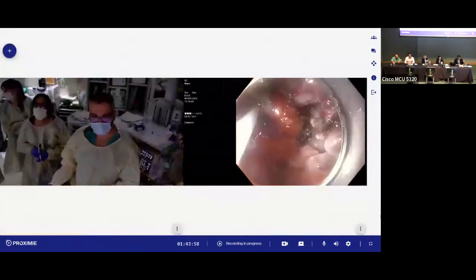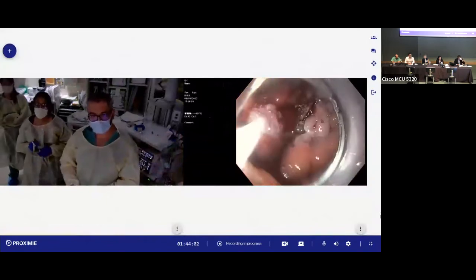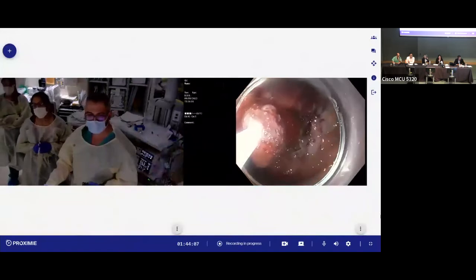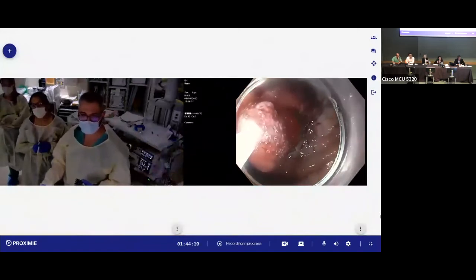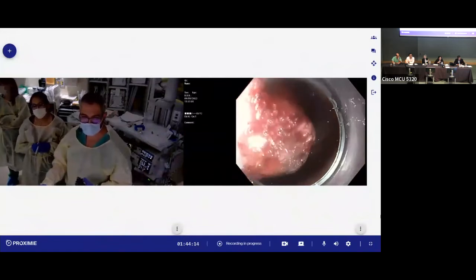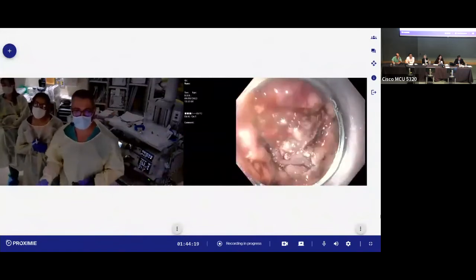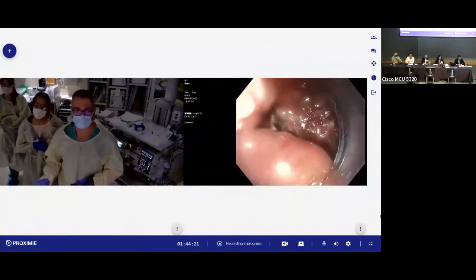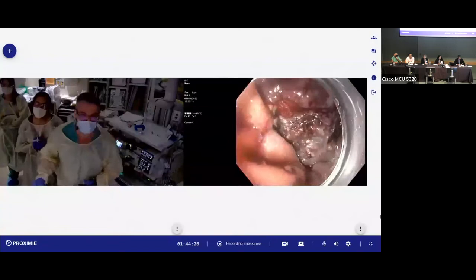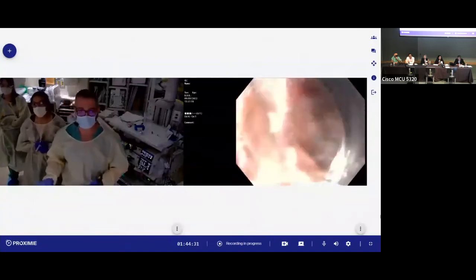Hello, we're back. Hello. We're almost finishing here. We're just in the last piece of the lesion. Tell us what you've been doing. You've been debulking from the endoscopic view. Have you had a direction that you've been working with, or just going with whatever comes? Basically we removed all the large parts, we can show it to you, and now we're getting all the way down. You can see here it's not pretty work because we have a lot of blood, but you can see the base here and there and here.